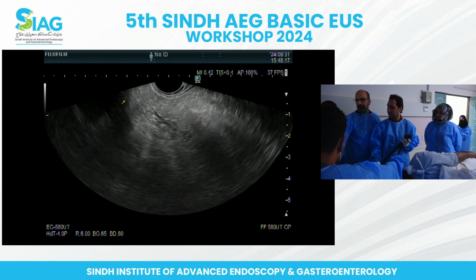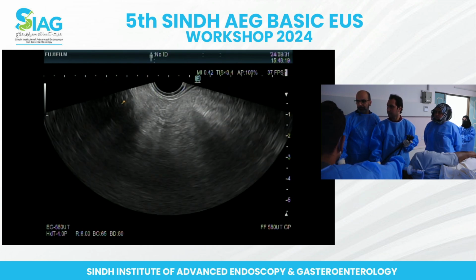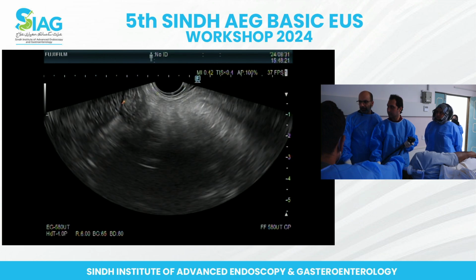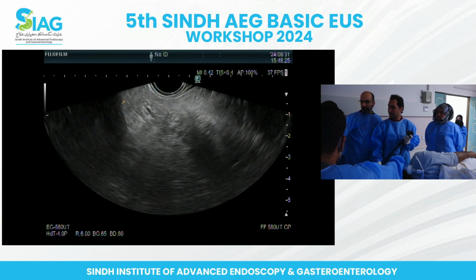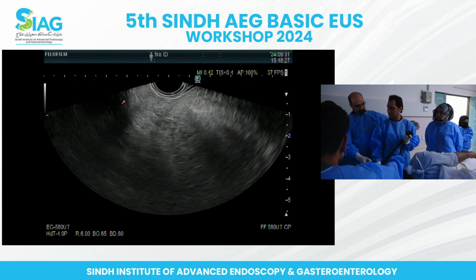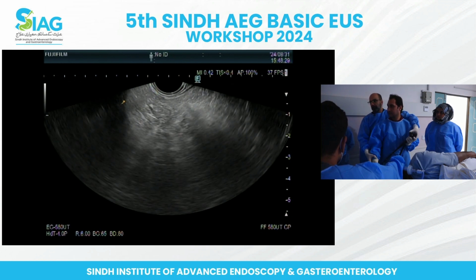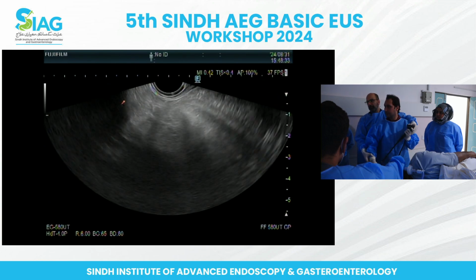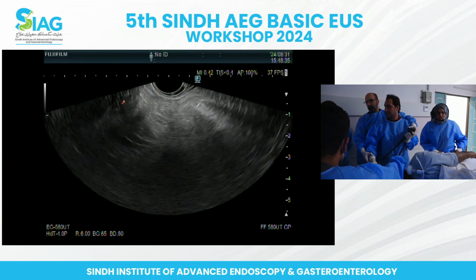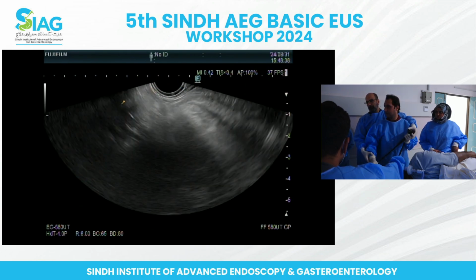So relax. Keep going counter. We're not really moving much here, so you have to just relax. Big wheel towards you a bit.